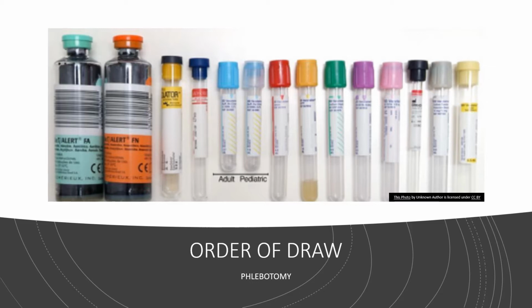But I'm going to be honest with you, depending on where you work, there are multiple. And in lab class, I'll show you just a small fraction of the different types and sizes and shapes of blood culture tubes that are out there at your disposal to use depending on where you work. But when we refer to this flower picture that helps you learn the order of draw, the first thing in that flower picture is that sun up in the sky that shines down on the flower.